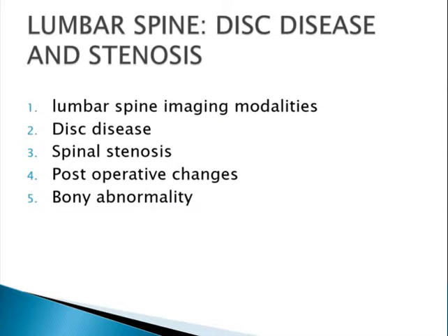Now we have reached the final chapter of neuroradiology, which talks about the lumbar spine, the disc disease, and the stenosis. And here we are going to talk about the lumbar spine imaging modalities, the disc disease, the spinal stenosis, post-operative changes, and we'll talk about bony abnormalities.